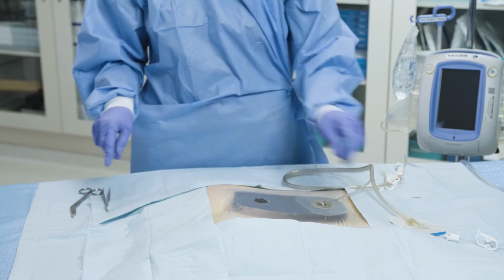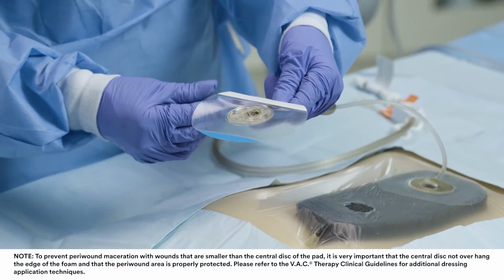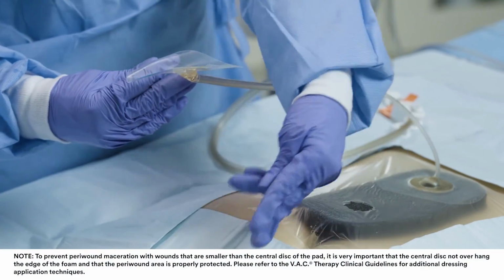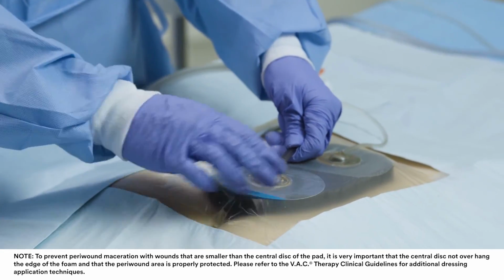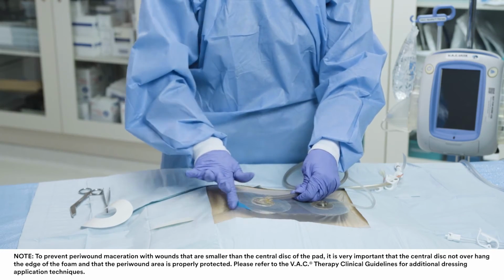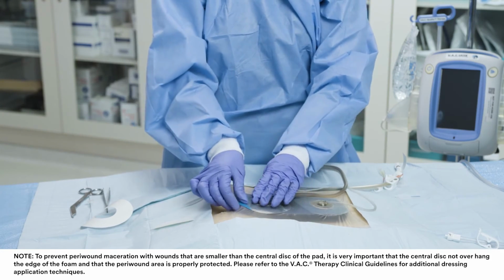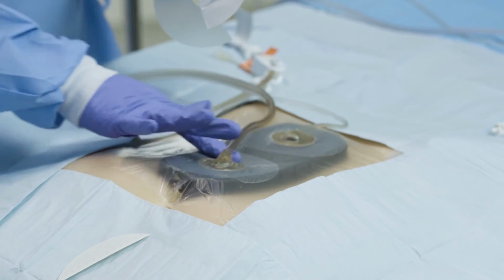Apply the VeraT.R.A.C pad. Remove both backing layers 1 and 2 to expose the adhesive. Place the pad opening in the central disc directly over the hole in the drape. Apply gentle pressure on the central disc and outer skirt to ensure complete adhesion of the pad. Pull back on the blue tab to remove the pad stabilization layer.